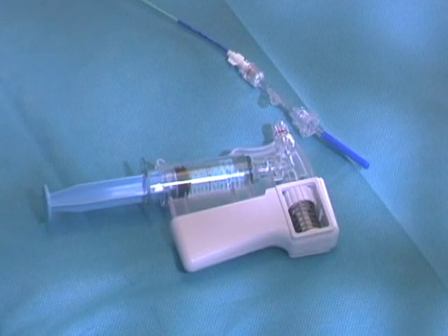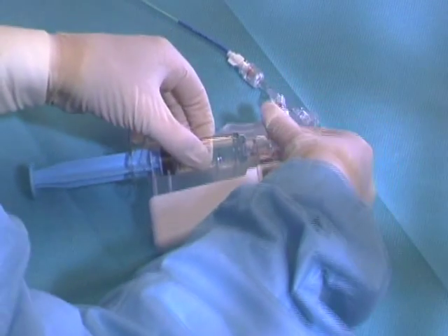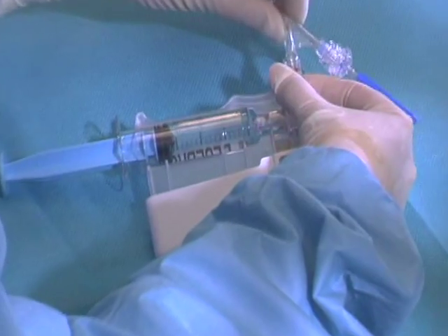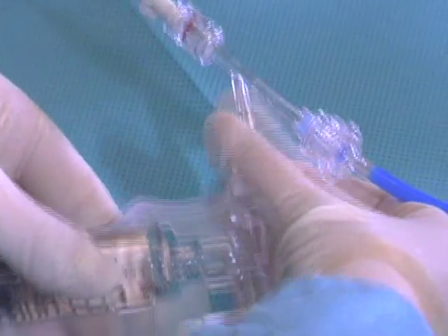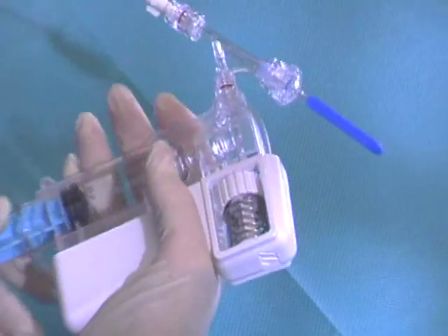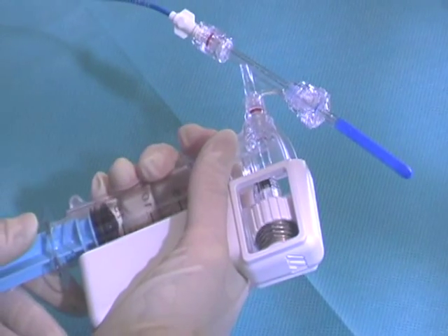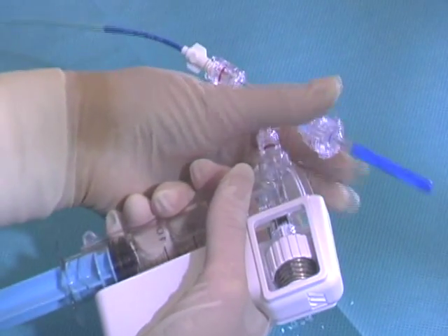To connect the Fountain to the Squirt, simply rotate the connector on the Squirt while attaching it to the hemostasis valve as shown. To avoid the introduction of air, loosen the hemostasis valve cap and allow a small amount of solution to flow back out of the hemostasis valve. Once fluid has gone through the valve, tighten it back down.